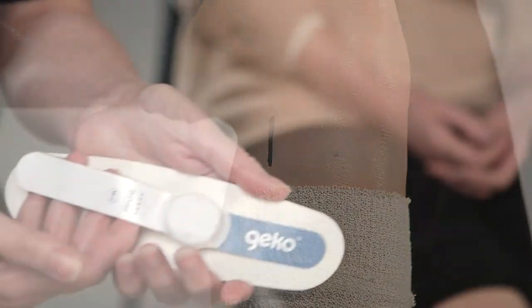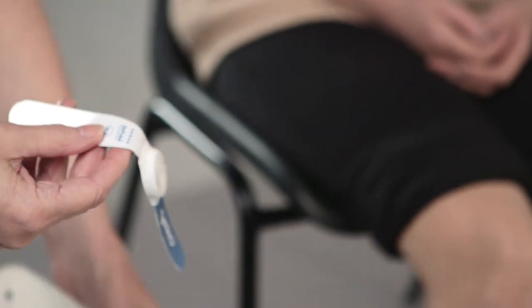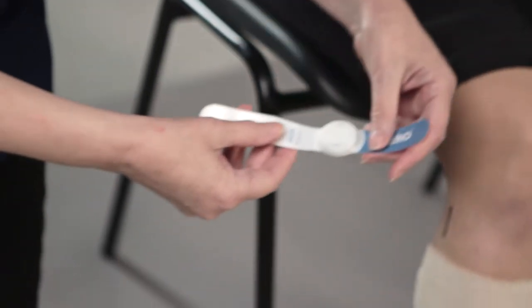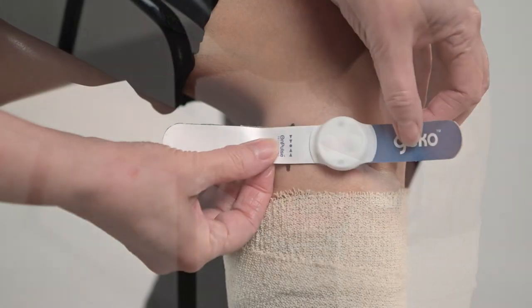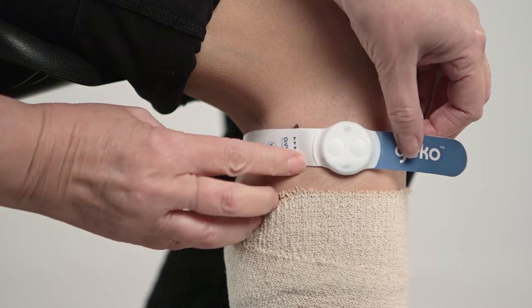With the device in the off mode, peel off the backing card. Secure the device to the leg with the patient sitting with the leg bent, so that the location marker — the line of arrows — is positioned directly over the center of the fibula head and aligned with the mark drawn on the leg.